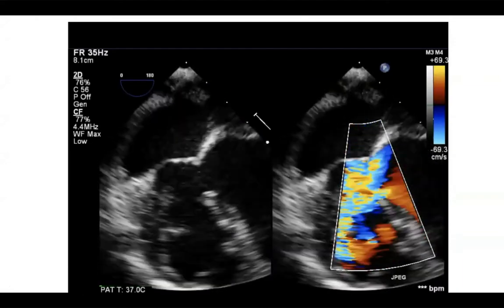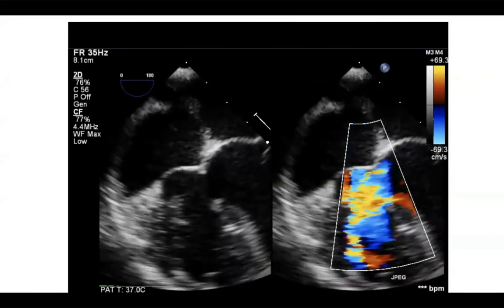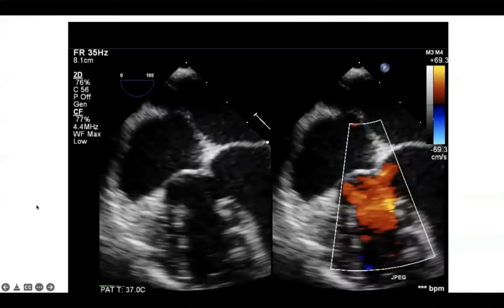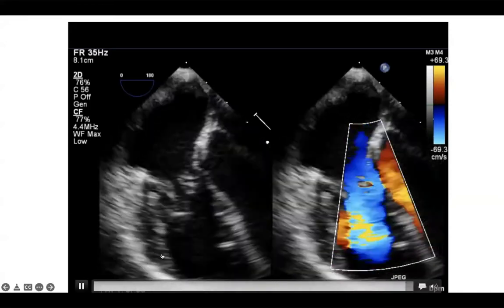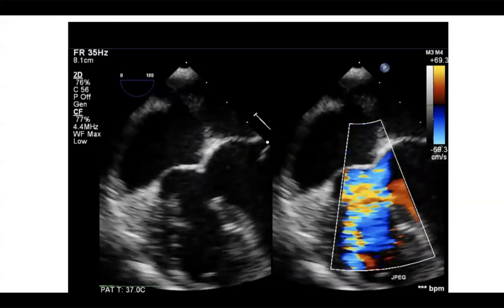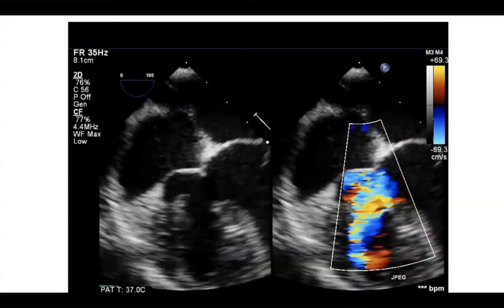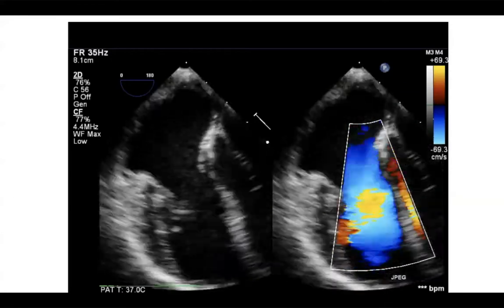I think that it's a big hole, but like I said, I've seen some of the cases now in Southeast Asia firsthand, and this device is remarkable. I would try this one definitely in the cath lab with this device. If I didn't have this device, I would not try a defect like this. I would send this to a surgeon. Yeah, so okay. And I guess the other devices we have, which LifeTech make, are the symmetric, asymmetric, and eccentric membranous VSD devices, which go up to 24 millimeters, but need bigger sheaths to deliver. And we've had good experience with them, even before and since the MFO was introduced.